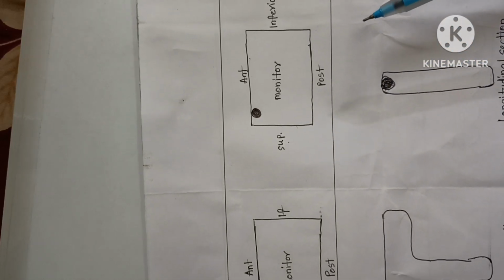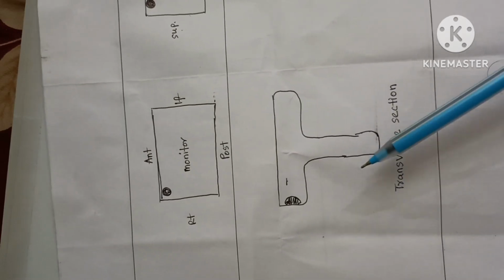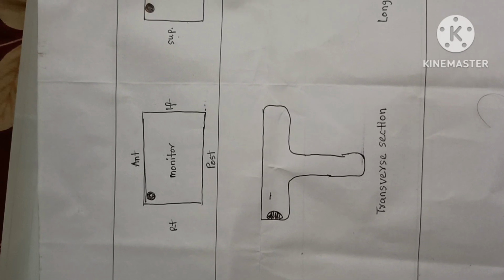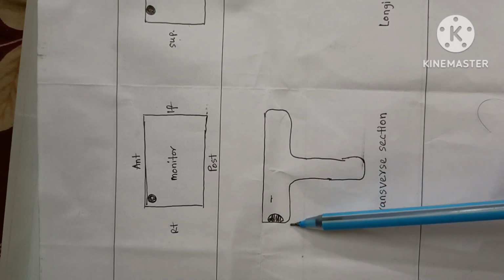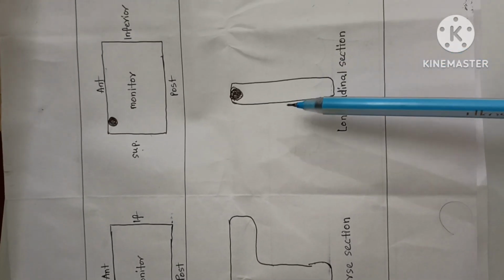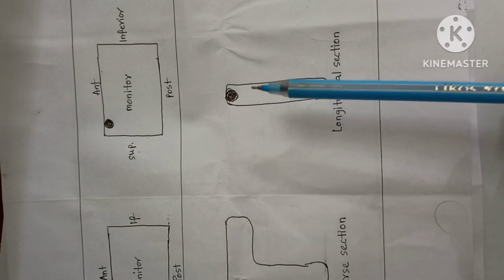Again, at last I am telling, in transverse section, you should position the probe marker towards the right side of the body. In longitudinal section, the probe marker should be towards the patient's head.